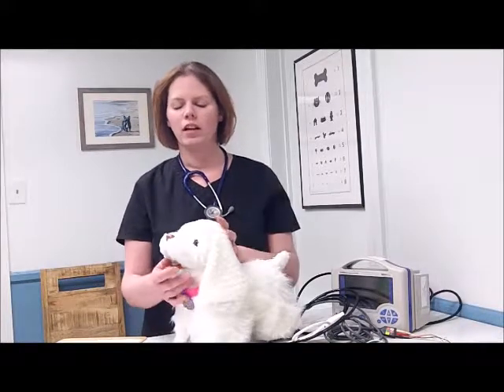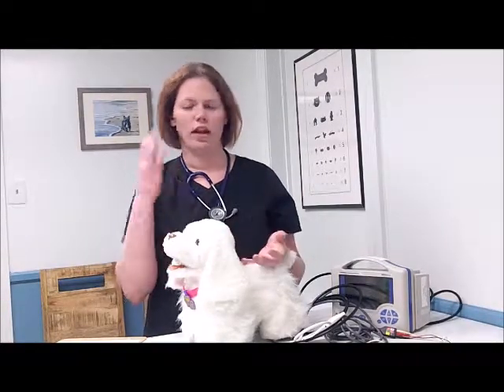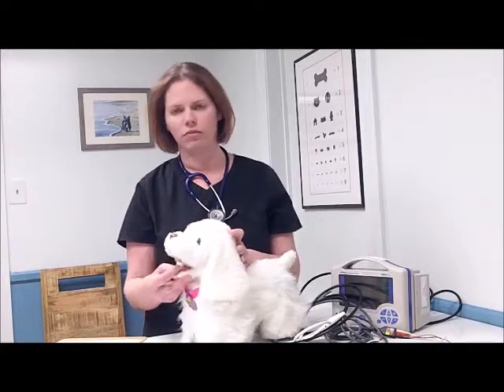Jaw tone or even muscle tone itself is another parameter. It's not the best parameter to use for anesthetic depth, but again, it goes through the stages. The more alert, the lighter the patient is, the more rigid their jaw is going to be, so the more difficult it's going to be to hold the patient's jaws open in order to intubate. They're going to struggle. It should be nice and loose, but not completely slack, during your moderate planes of anesthesia. If you are too deep, then there is no muscle tone. That jaw is loose, it just flops for you, and we definitely know our patient is too deep then.